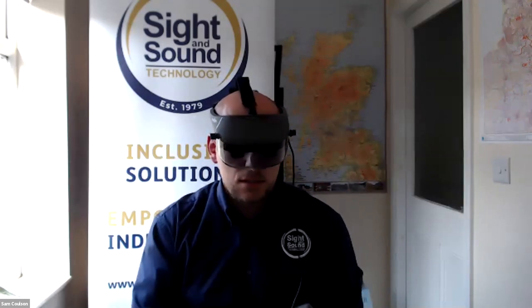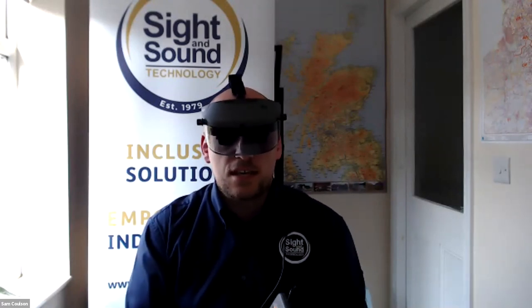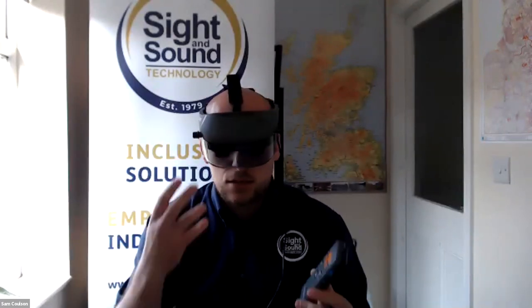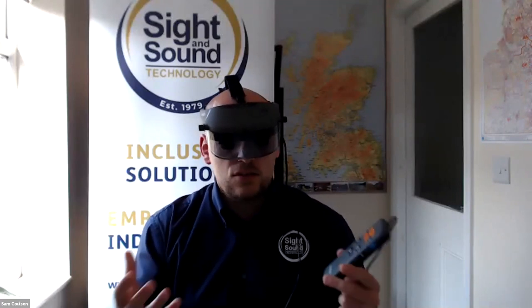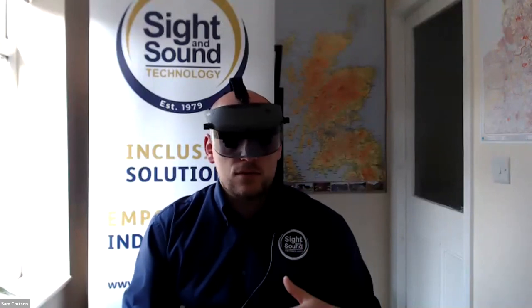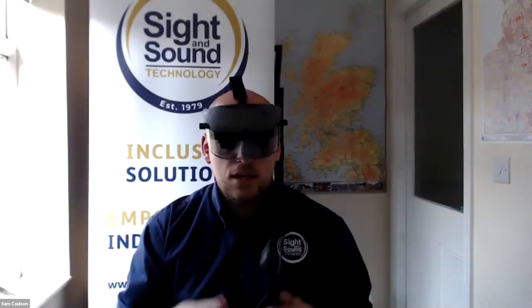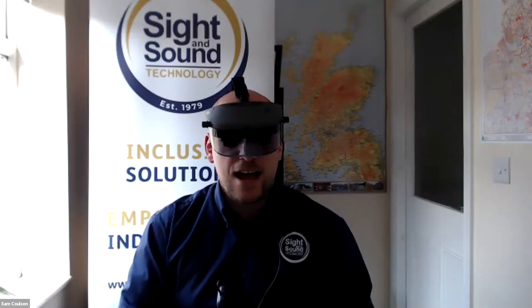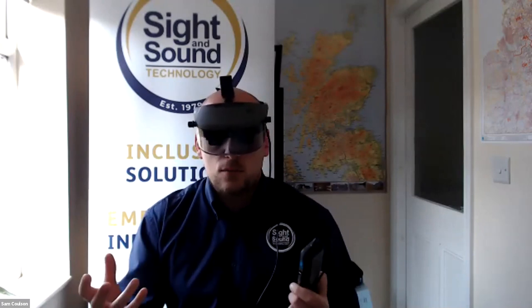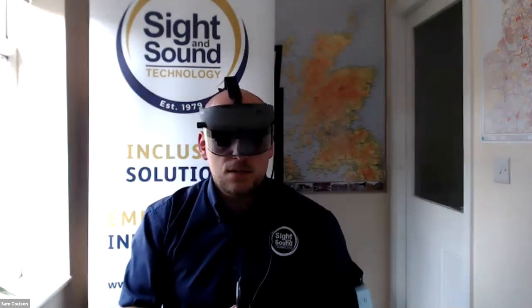Now, this is important. I can't see this. The outline modes do exactly what they say on the tin. They stick an outline around people, objects, anything that comes in front of the camera. This is great for navigating your way around a room, for instance. Obviously, this can be used outside. I'm aware that people may feel a little bit anxious about using this outside because of the size of it. But this is perfect for obstacle avoidance. The outline mode sticks a big thick line around the outline of the object.